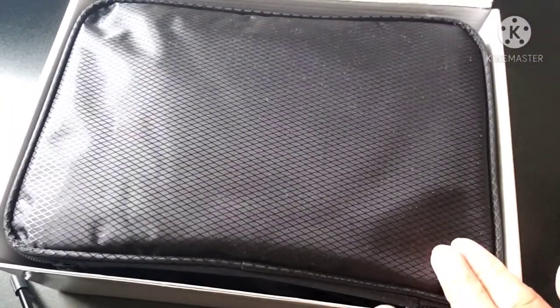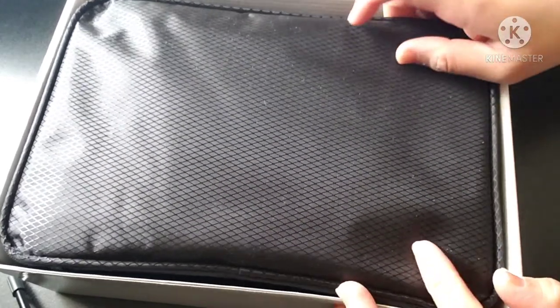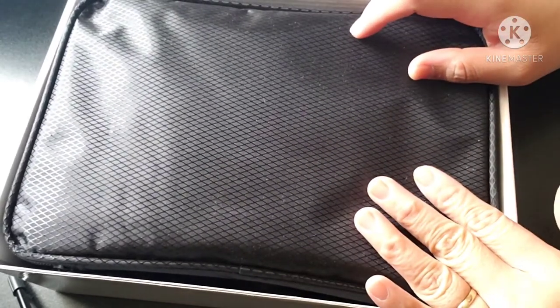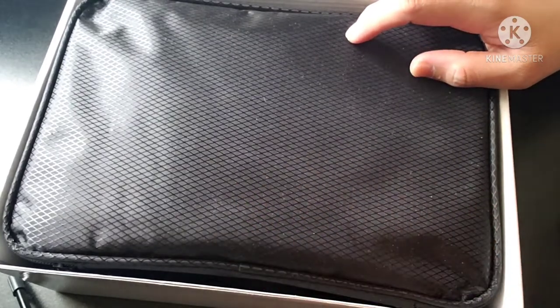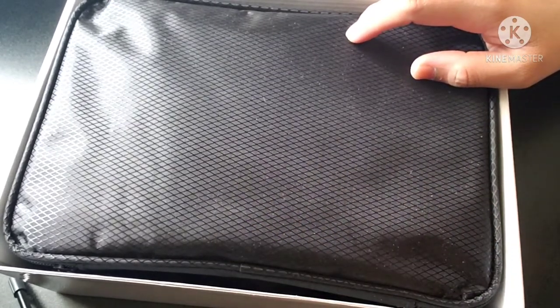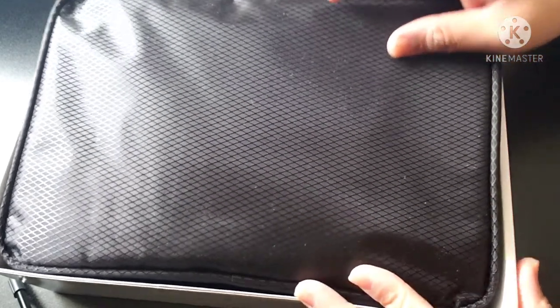So it comes with a black bag, which is great for keeping everything organized so things aren't put in different places. Let's take it out and check what's inside the bag.